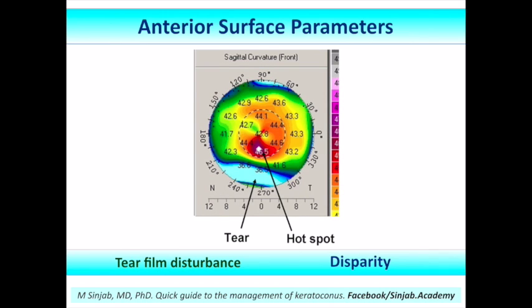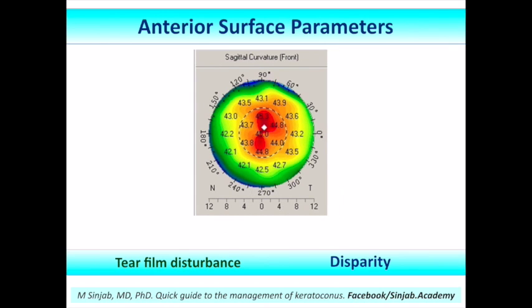At the same time, when we have excess tears, the computer will understand the spot over the tear film as a hotspot. So just give the patient a tissue and dry the eye and everything will be better.